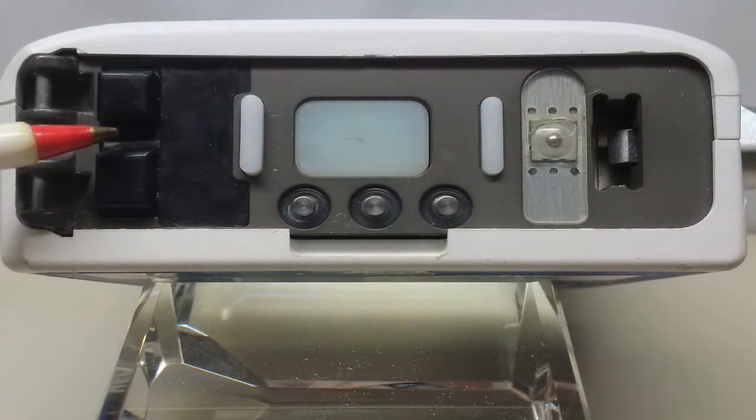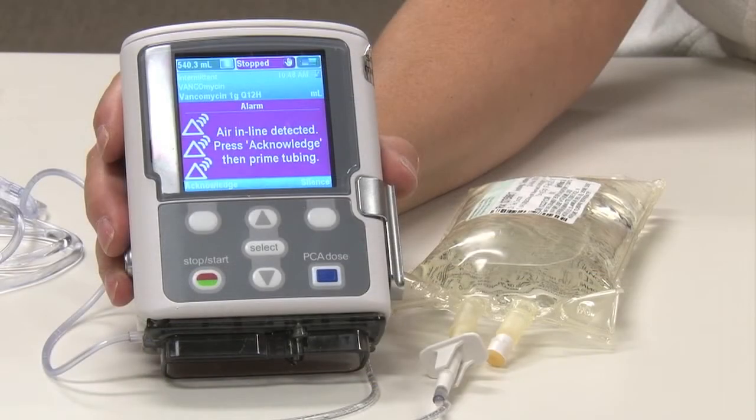Let's look at how we can minimize these disruptions by firstly preventing the alarms from occurring and then addressing how to manage the alarms. If a single bubble greater than 400 microliters is detected, the pump will alarm. In addition, the pump also calculates the amount of small air bubbles passing the detector — if there is a buildup of more than 1 ml in 15 minutes, the pump will alarm.